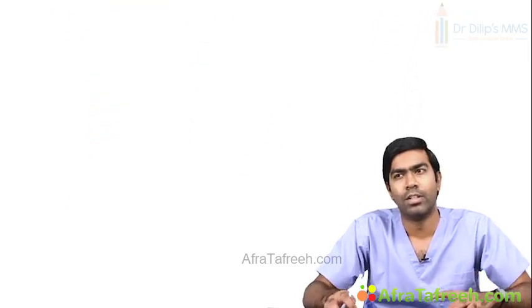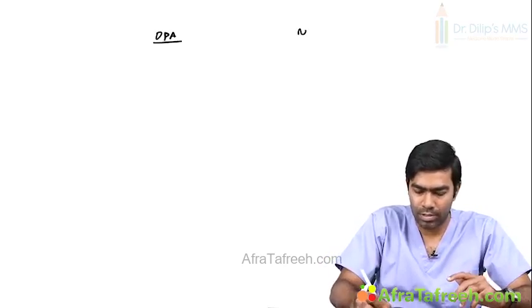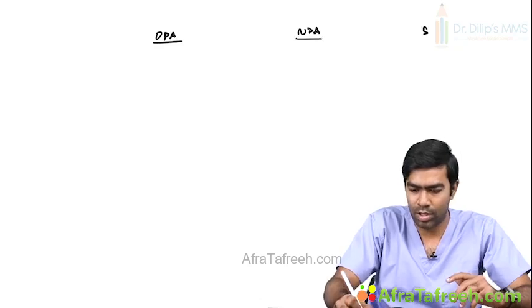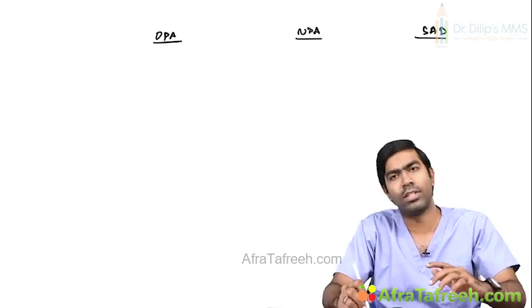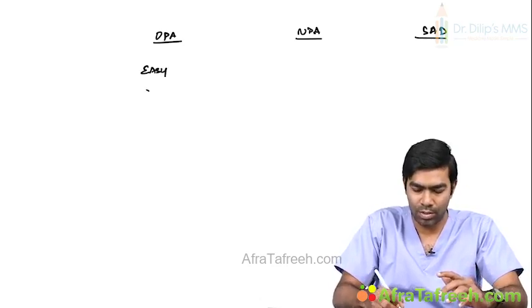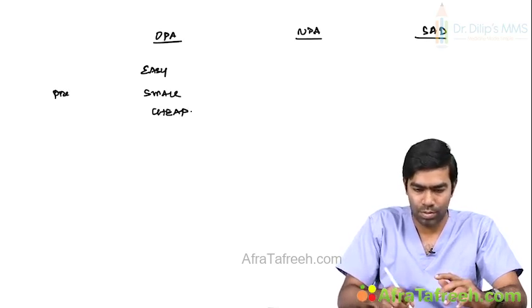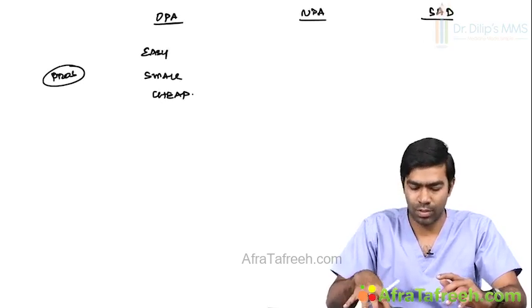Fine. So now let us compare and contrast the oropharyngeal airway, nasopharyngeal airway and a supraglottic airway device. Remember, the oropharyngeal airway is easy to use, very small and extremely cheap. So this is the pro. You have a lot of cons also with the oropharyngeal airway.